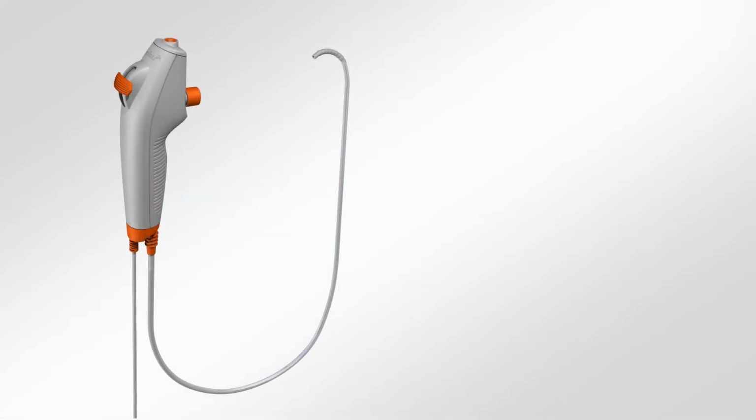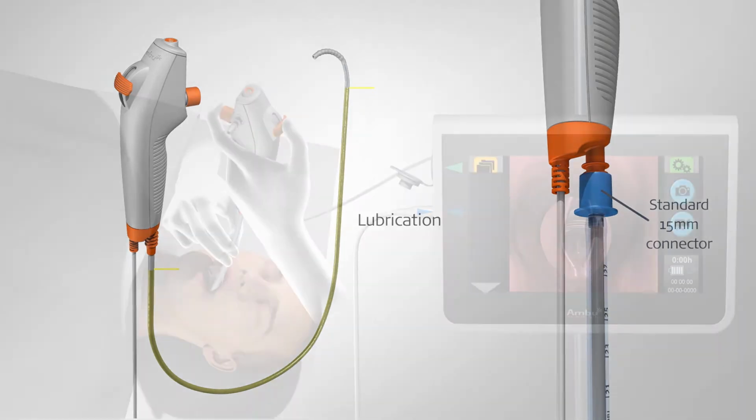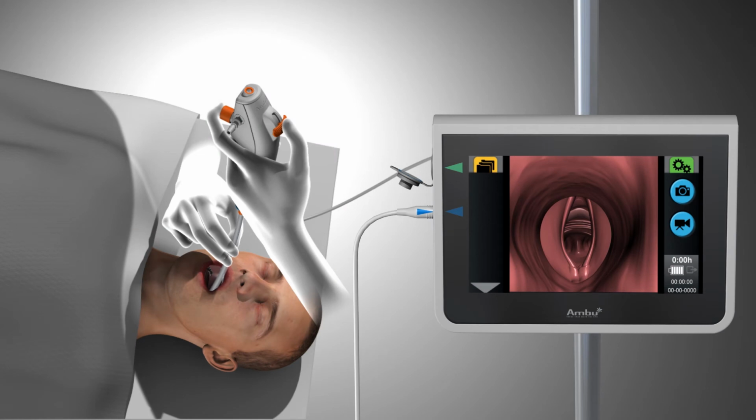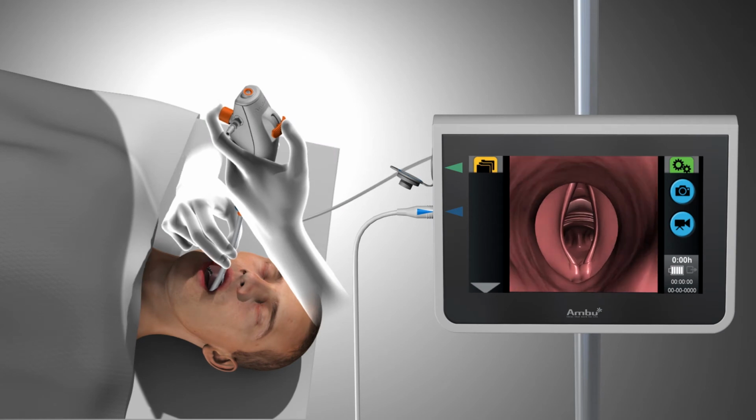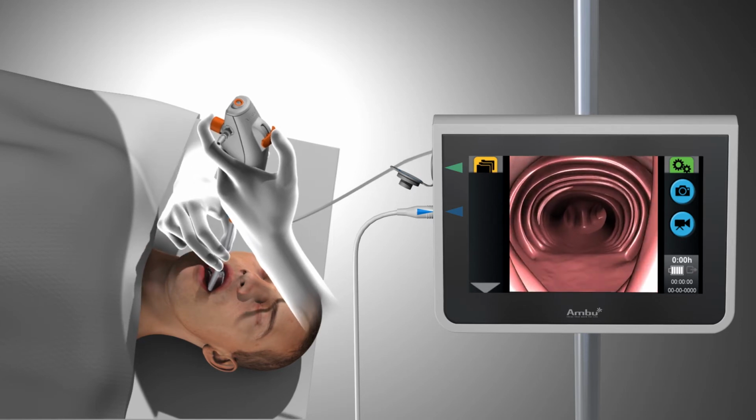The aScope can be used to assist in intubation. To begin, lubricate the insertion cord to the gray line mark using a medical-grade lubricant. Make sure not to get any on the tip or camera. Mount an endotracheal tube. To insert, hold the handle of the aScope in either hand and use the hand not holding the aScope to advance the insertion cord into the patient's mouth or nose.